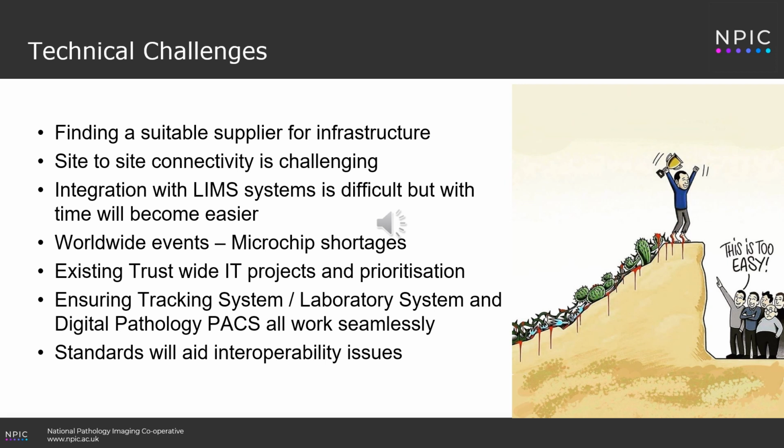And I guess the final point is linked to standards. And what we feel is standards will aid interoperability issues and will support the ability for seamless transition between systems or sharing of images between different systems.